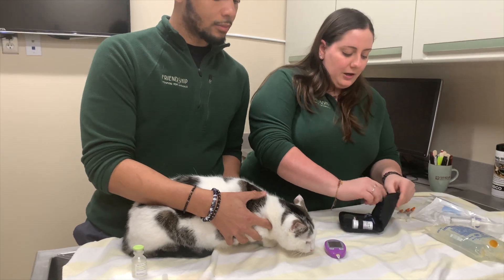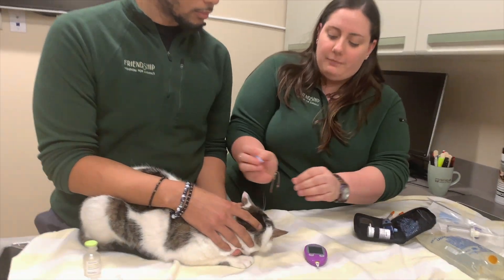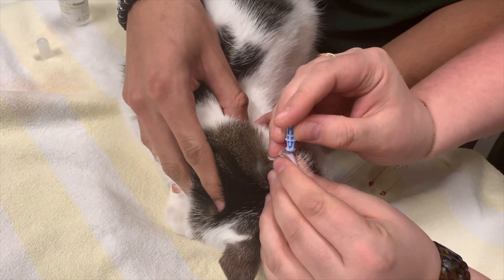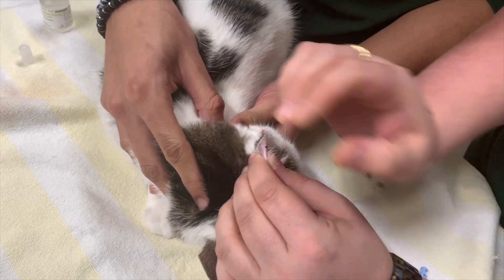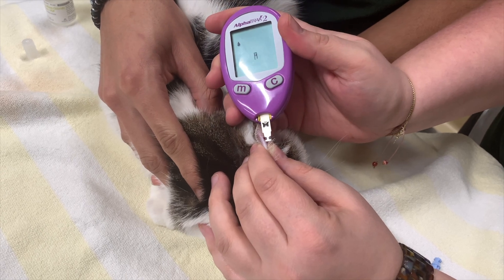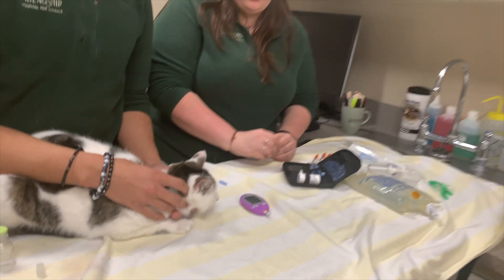Brandon will hold Butch for us, and we're going to use one of these little lancets just to get a little bit of blood from his ear. We'll hold it like this, poke his ear, and then wait for the blood. What a good boy, Butch! Then we'll suck that blood up with the little strip. Once we get that, the machine will beep and give us our glucose reading.